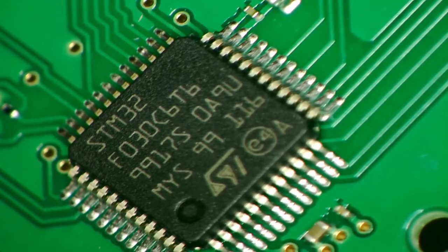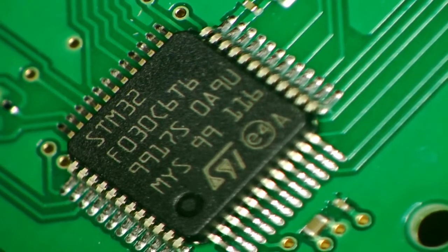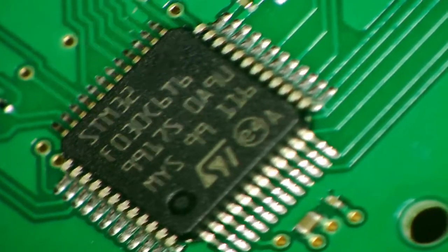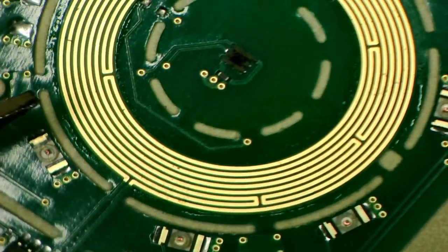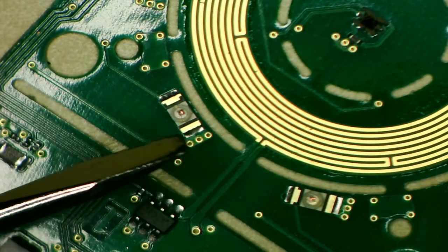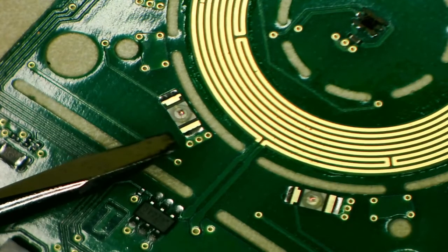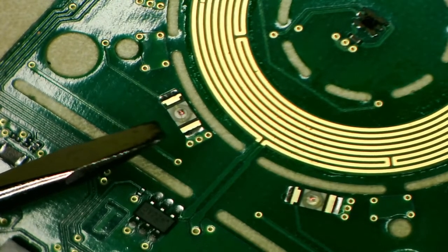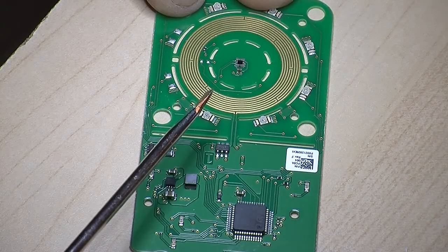That's the part number, and what we'll do in a minute is actually look it up and see what they've probably used as the microcontroller. All right, let's zoom out again. And anyway, the other interesting thing is this big area over here. And these little things here, which I'm going to point to with a screwdriver, are almost definitely LEDs of some kind. And based on things I've heard about the lamp test, my guess is they're probably UV LEDs, but I might be wrong. They could also be blue LEDs, which would be the most likely other option.